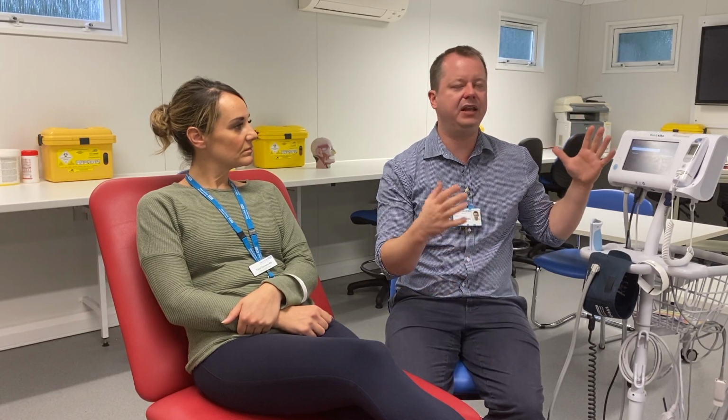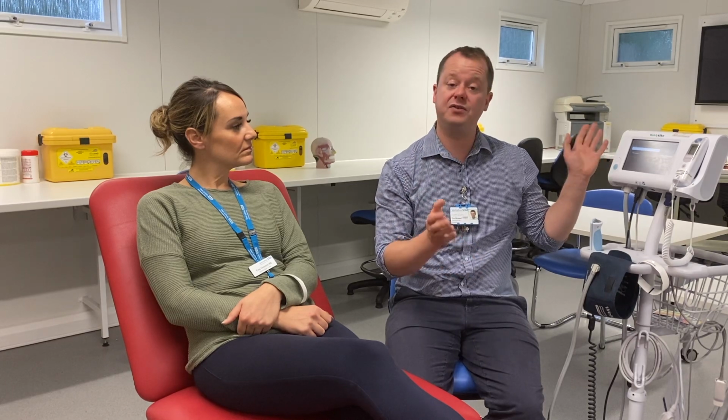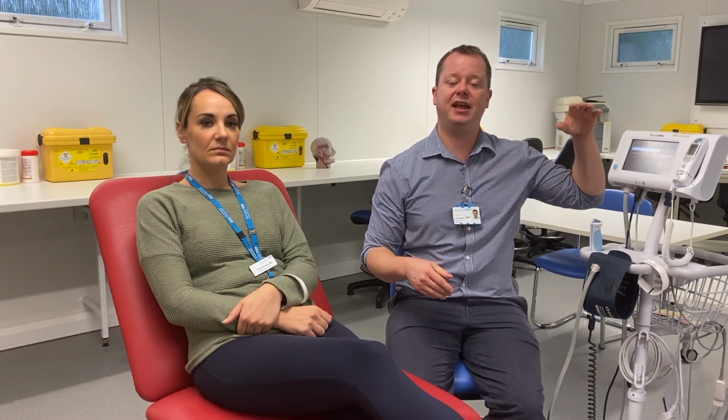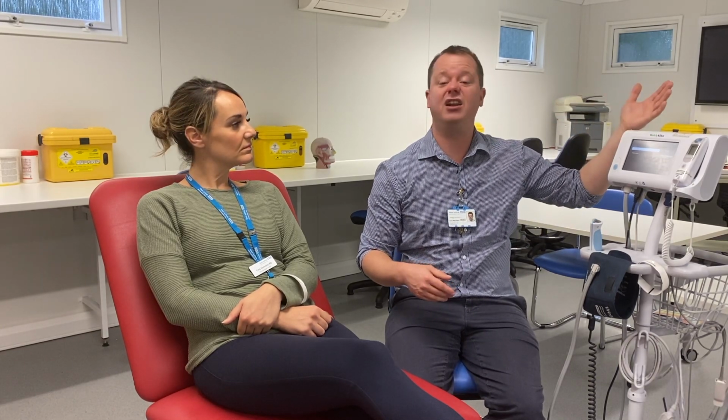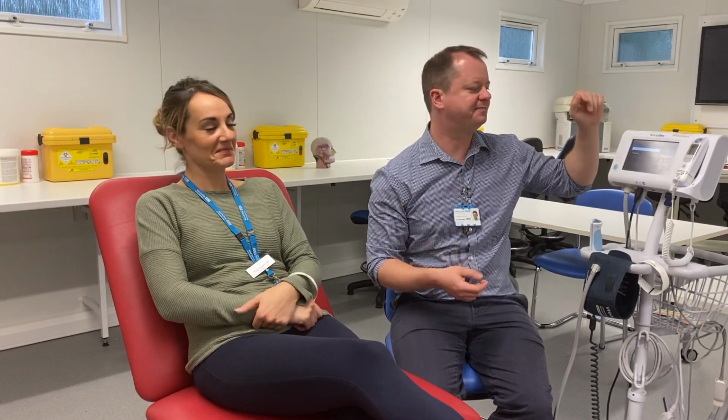There are about a billion different OBS machines around the world, so we can't show you every single one, but they all follow a basic principle: turn it on, press go to record the blood pressure, put a SATS probe on, and then silence it when it alarms. Really, or you do something about it. Do something about it, yeah.